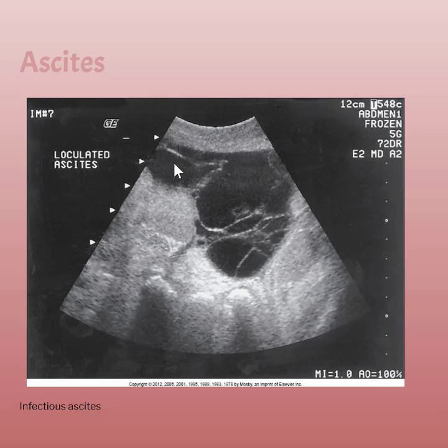If this patient were to have a paracentesis, the needle would actually need to pierce through these loculations if they are completely closed off to get the fluid out of them. So we want to make sure that we are visualizing that needle and where it's going when we drain these patients.